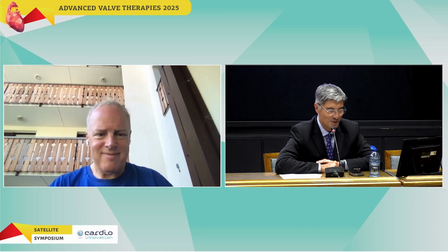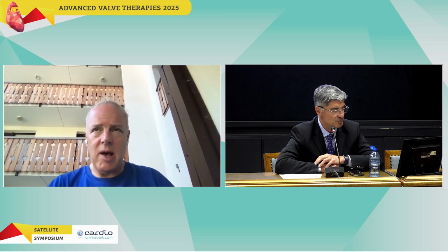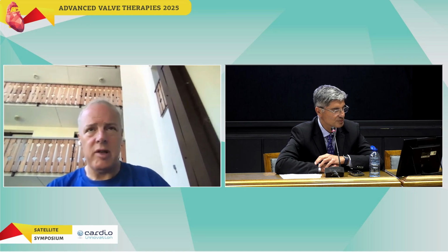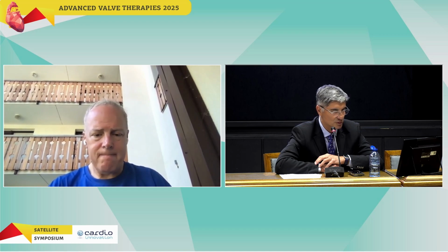So there are some surprises as well. I don't know that. So I suppose that there is an enhanced skirt, right? It's not a fully circumferential skirt. It's what's called a V skirt or a labyrinth seal. We already have preliminary data on the first 60 patients that have been treated with this device, and it looks like it works extremely well.